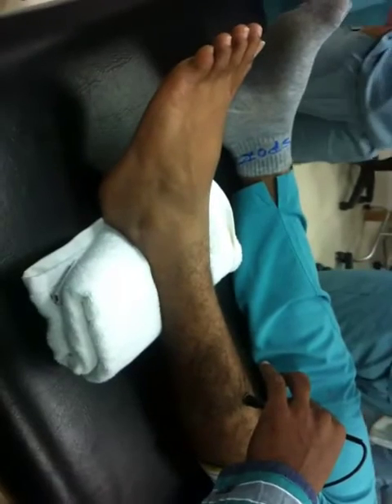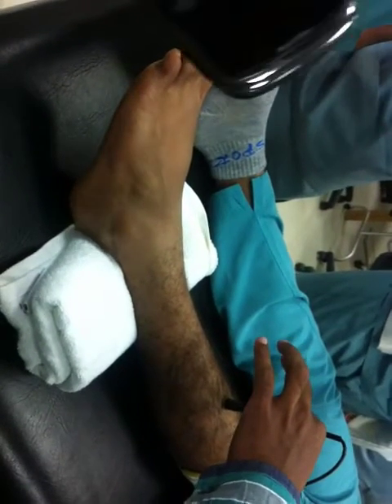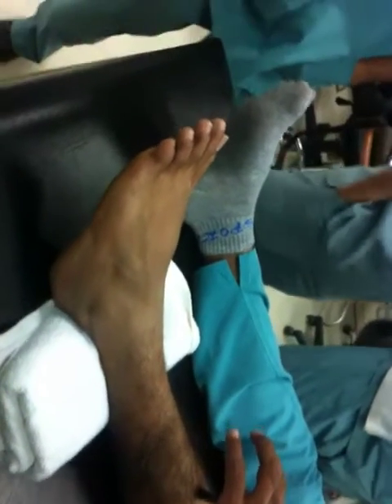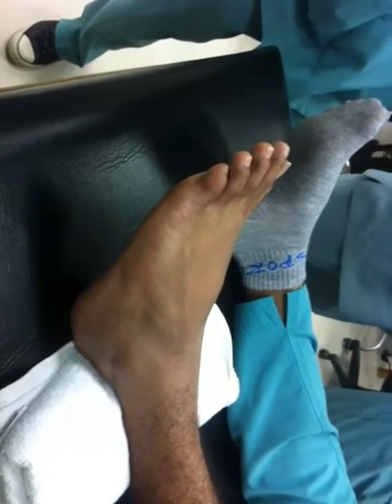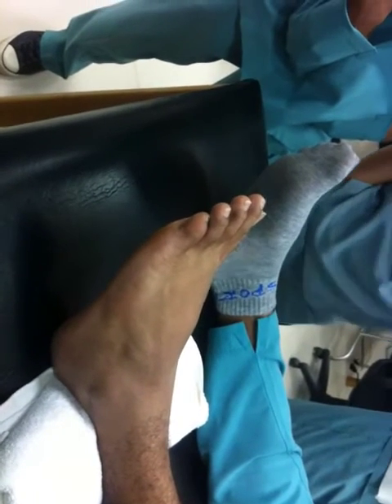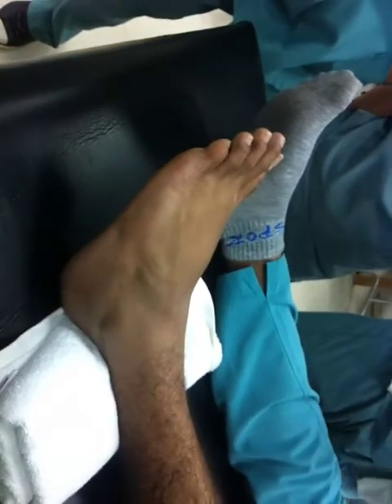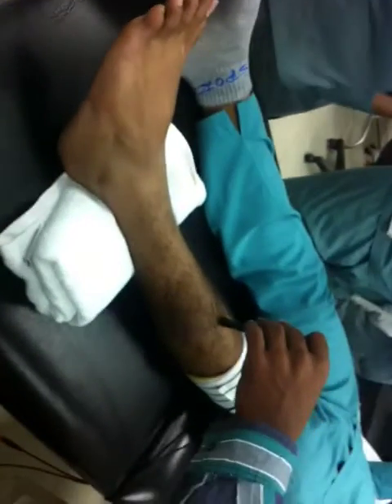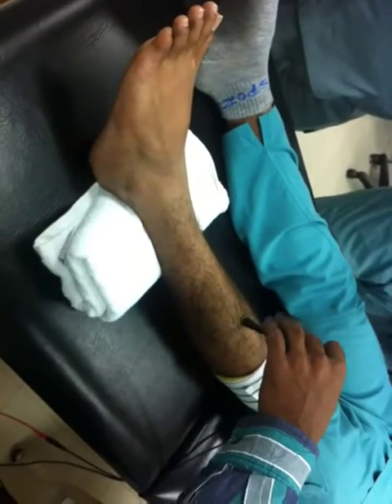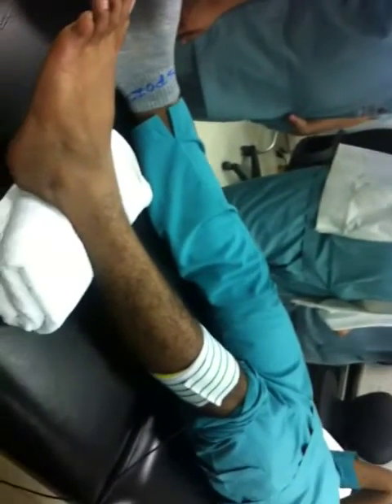For tibialis anterior, they should do dorsiflexion — dorsiflexion along with little inversion. Are you getting the pattern? This is the maximum, but it's okay. It performs both dorsiflexion and inversion. Actually this will be associated with tibialis anterior — you can see a little upward movement. Tibialis anterior performs both movements: inversion with dorsiflexion, like ulnar deviation with flexion. The hair offers more resistance for the current.